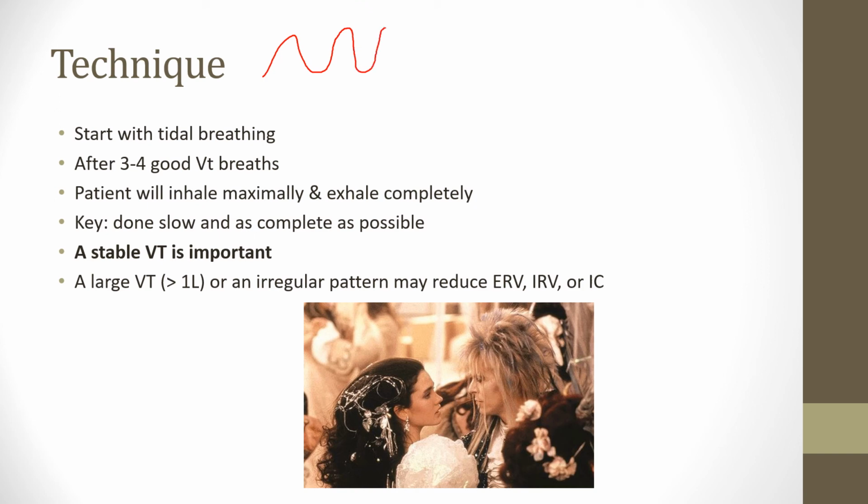And once you have about 3 or 4 breaths that are roughly within the same area of each other, you're going to have the patient take a maximum inhale as high as they can, and then slow, sustained exhalation till they can't exhale anymore, and then back to tidal volume breathing again.